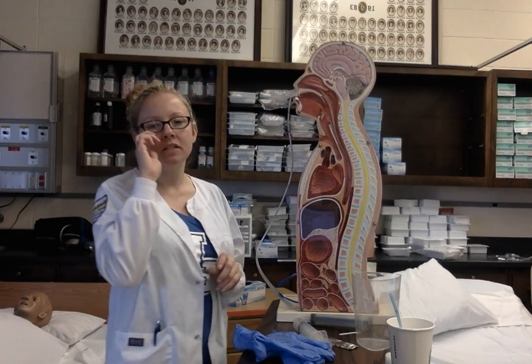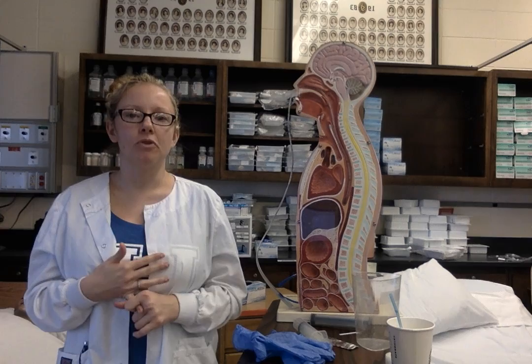To remove the NG tube, I'm going to verify the orders for the patient. I'm going to perform hand hygiene, ID the patient, provide for privacy, explain the procedure, assess the abdomen, and position the patient to a 30 to 45 degree angle.